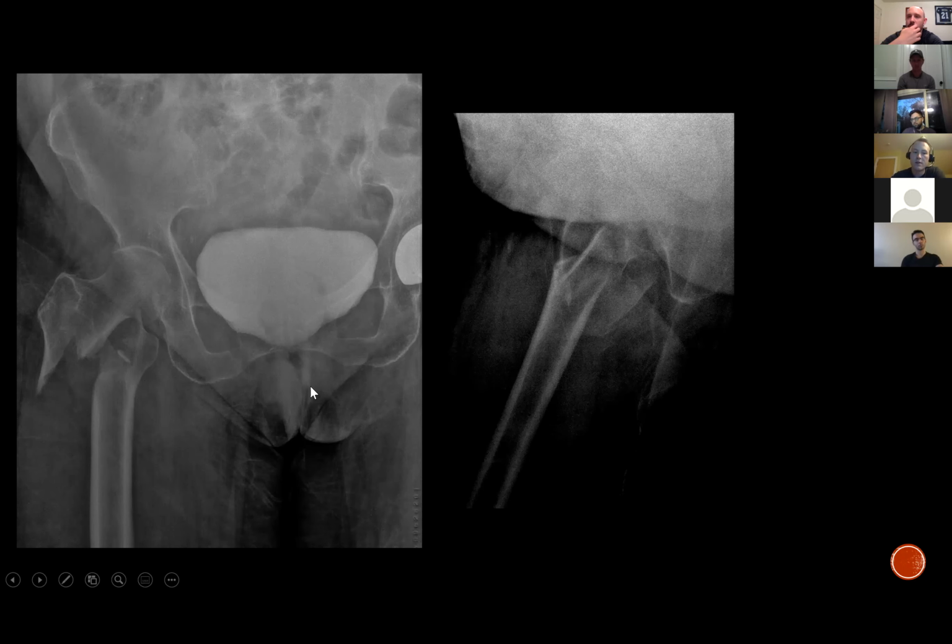We're going to treat this very differently than we treated that femoral shaft. This is going to be done typically on a fracture table, that one where you have the leg suspended and it's in a holster. But you can see these fractures have a very distinct deformity, and they're commonly very far out of a reduction. You can't just nail this and hope that the nail puts it back in place. So you have to do something. Typically, here is no traction applied on a lateral view. And then once we've pulled on the leg, a lot of the reduction is done for us, but it's still not perfect. So we can go in, put a couple of clamps on, reduce the fracture. If you look at this cortical line here, you can see it lines up much better than it did over here.